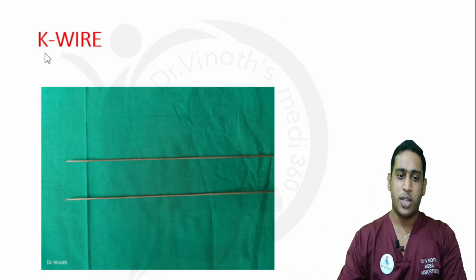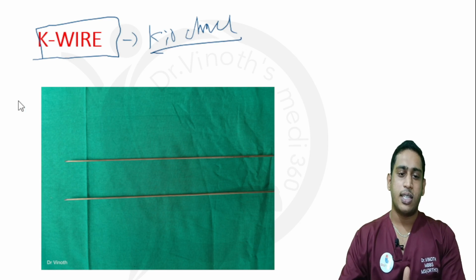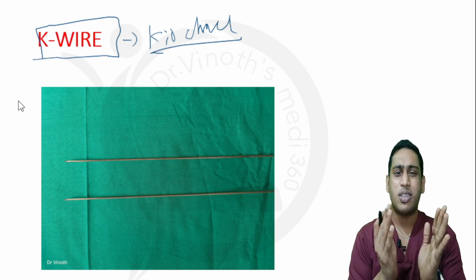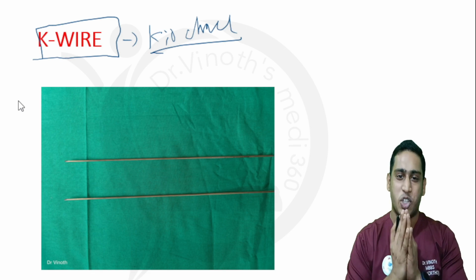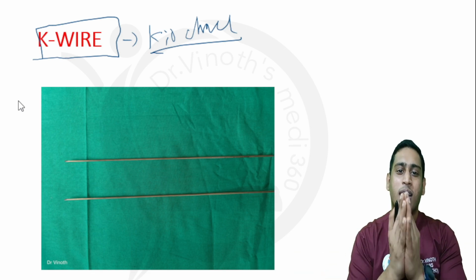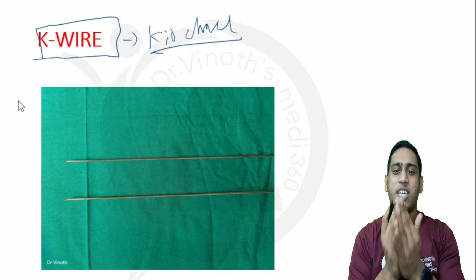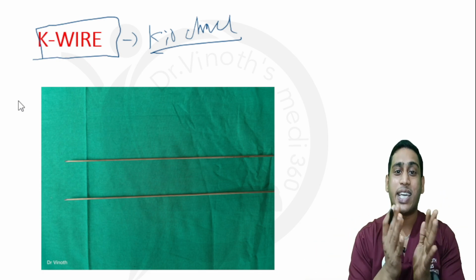Then coming to the routinely used implants. The first thing will be the K wire, also called Kirschner wire. Without K wire you cannot do any surgery in orthopedics. Any surgery is not possible without a K wire, because in maximum surgeries, either internal fixation or external fixation, we need K wires.